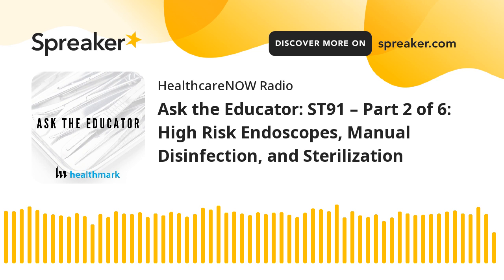But then we're left with our duodenoscopes, and that is a challenge still to sterilize. But really think about keeping your eye on new types of sterilizers that have come onto the market that do have clearance for that. We also have ethylene oxide, which has always been compatible in the endoscope manufacturers' IFUs, although not widely used anymore. And then hopefully we'll see new endoscopes come out that have better compatibility with sterilization modalities, as well as sterilizers, or new types even, that have the clearances for sterilizing those duodenoscopes, because we do need to do something more with them.